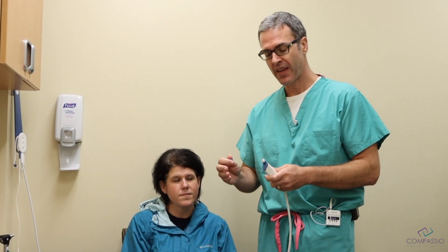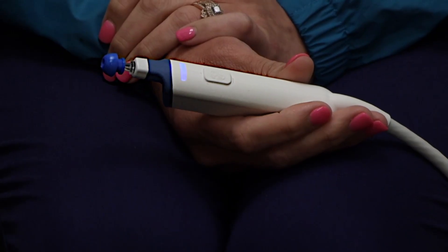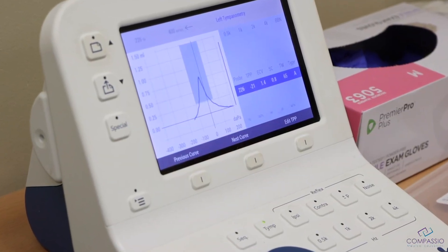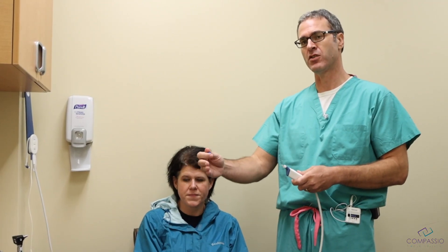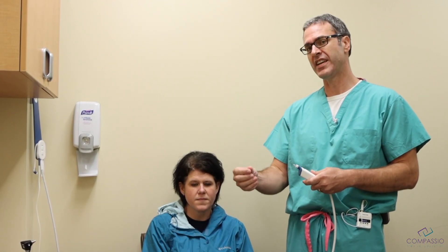We have a tympanometer, which is basically a device that measures the movement of the eardrum and the condition of the middle ear — the space behind the eardrum. This will tell me if there's fluid behind the eardrum, if there's a retracted eardrum, or if there's a hole in the eardrum.